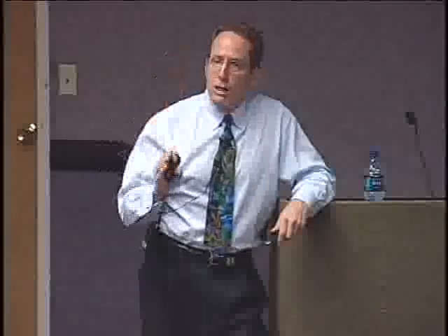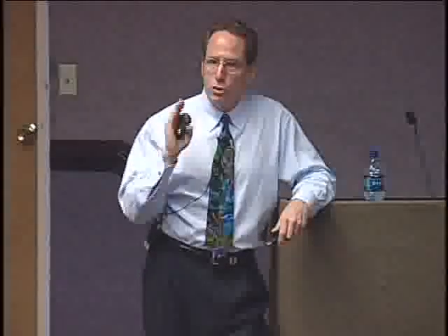Imagine, now you've got a mass that looks category 4. It needs to be biopsied. We send you to an ultrasound to guide the biopsy. And you go to somebody who's not trained and they say, normal tissue. You walk out. Uh-oh, you might have a breast cancer that was completely missed, namely sampling error. They didn't even pass a needle in there. You got given the green light when you shouldn't have. It requires expertise to do ultrasound. Don't fool around.